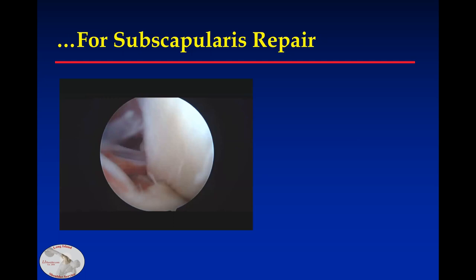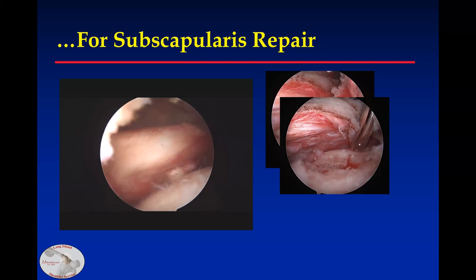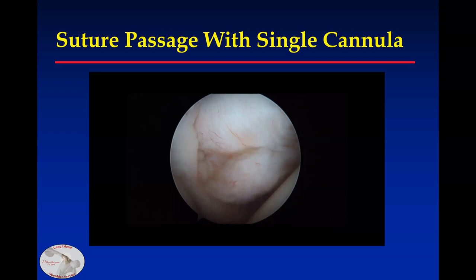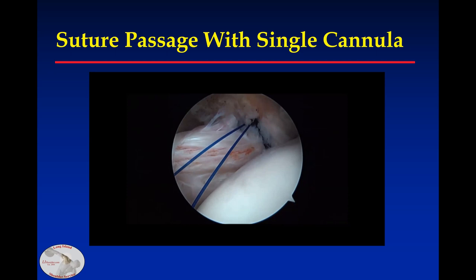This is a case where the biceps is perched. Here's the tear of the subscapularis. With the arm flexed, you can see the lesser tuberosity denuded of soft tissue. Do your releases and place your anchor as shown above. You'll pass your crescent-shaped hook from anterior, retrieve your zero Prolene, and pass the repair suture back through the same cannula. If you do it this way, it won't confound with the other sutures. Repeat that for the remaining sutures in the anchor.